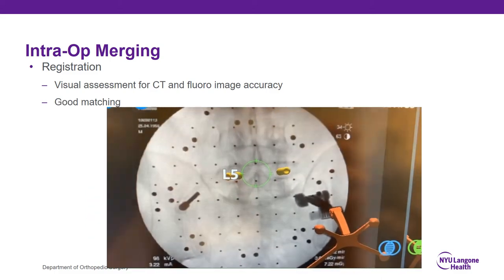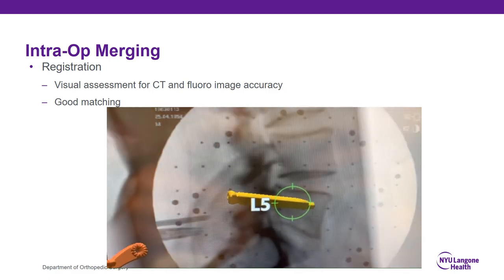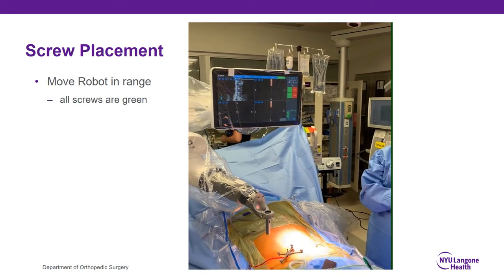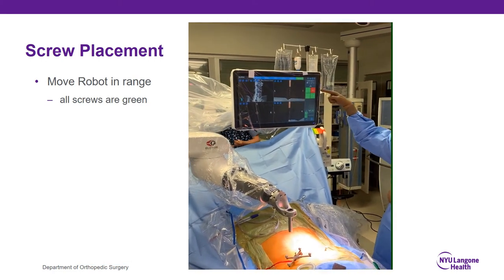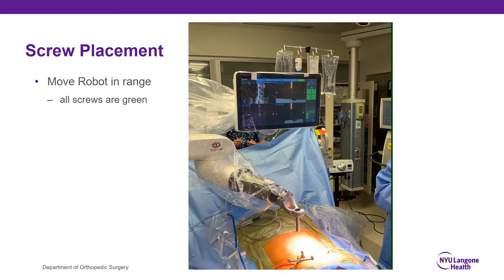Here we redid the registration and you can see the end plate is getting darker but not actually moving as much — that's a much better match. Then I check my screw plan to make sure where the software is dropping the screws matches what I would expect based on my pre-op plan. Then I need to move the robot into range. The four boxes on screen represent each of the four pedicle screws, and when they go from red to green that means the robotic arm can reach all four trajectories.